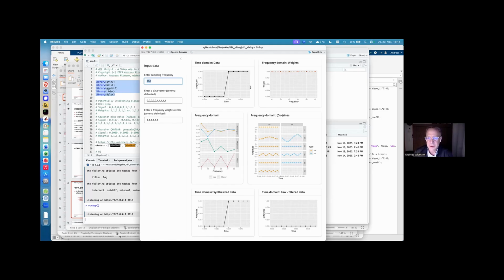And that is exactly what we now do. So that is the 0 hertz DC component. Okay, 0 hertz is no oscillation, it's just a shift. But then we have the 10 hertz oscillation. So we have 10 hertz of oscillation of exactly the same length. So this is the same length as our time domain data. And we have a cosine component and the sine component here with a negative number.